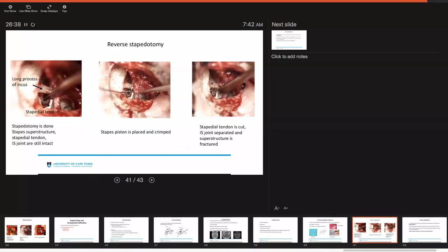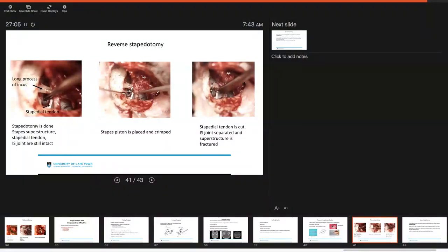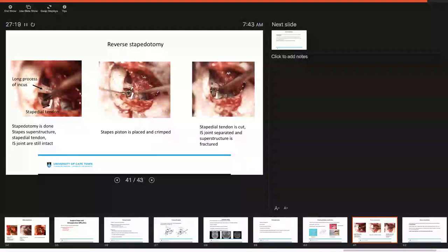And then lastly, we just wanted to talk a little bit about reverse stapedotomy, which we commonly perform at our institution. In essence, you can see in the image in the left, you can see the long process of the incus and you can see the stapedotomy. A stapedotomy is done. The stapes superstructure, stapedial tendon and the incudostapedial joint are all still left intact versus taking those down first before doing the stapedotomy. With these structures intact, the stapes piston is placed and then crimped. And then subsequently, the stapedial tendon is cut and your IS joint is separated and the superstructure is subsequently fractured off. And that's really a reverse stapedotomy.